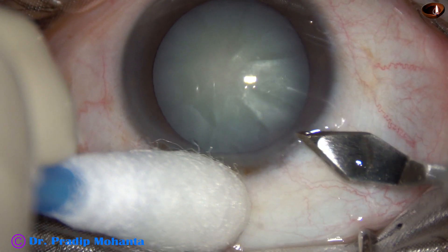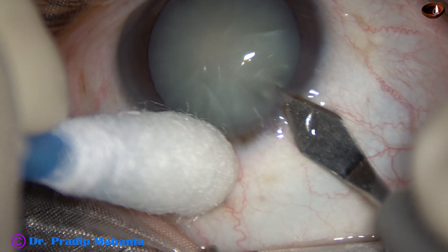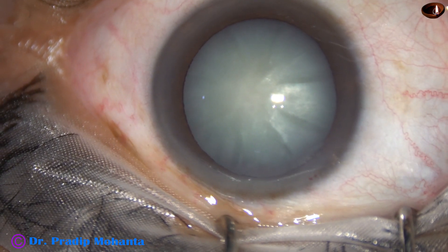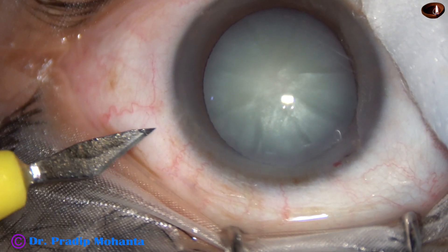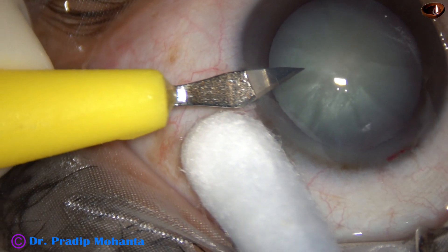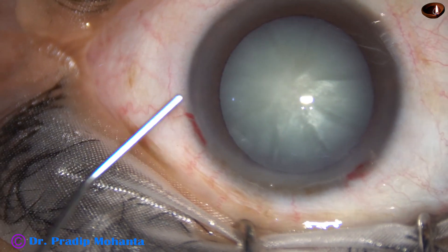This is the main incision at mid-limbus with a 2.8mm steel keratome. Now a side port is made 3 clock hours away from the main incision so that astigmatism induced by the main wound is neutralized to some extent by this side port. Width of this side port is about 1.8mm.